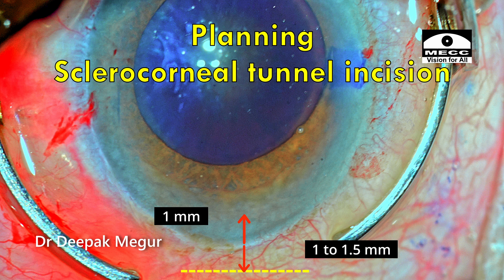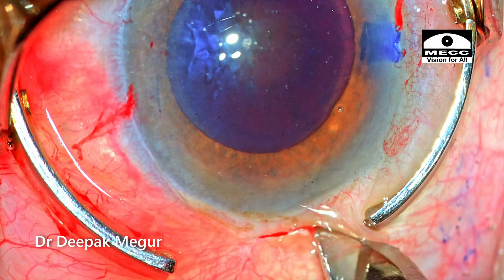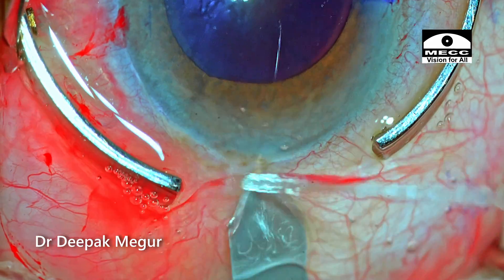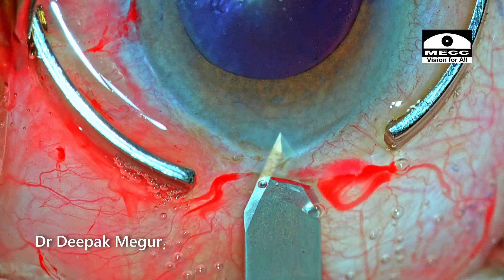A second possible benefit is that in the worst-case scenario, if I have to convert to manual small incision cataract surgery, I can use the sclerocorneal incision to create a scleral tunnel on either side and deal with the situation. The initial transconjunctival cut is slightly longer than the 2.8 mm incision to ensure there is no conjunctival chemosis during the phacoemulsification process.